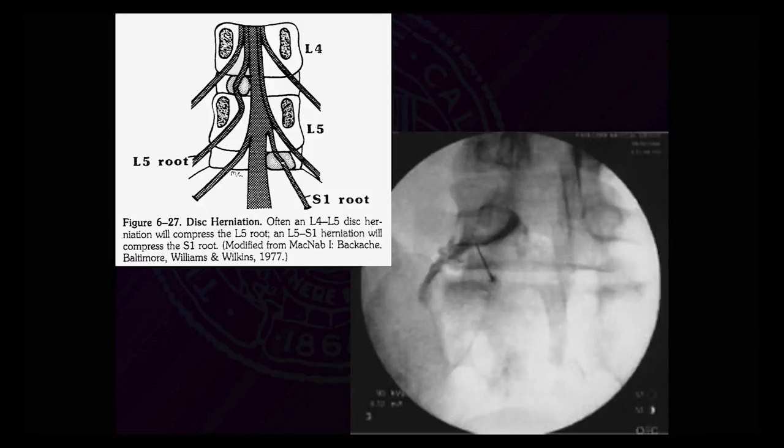So how do we do these? Sometimes we meet patients who say that, well, I've had these done just in the office and they never used anything to show us where the needle would go. And that can be a way to do some injections, but clearly if there's image guidance, it will have a more precise and accurate placement of the needle and the injection. So most people having these injections will probably have them under regular x-ray, and that's an example here.